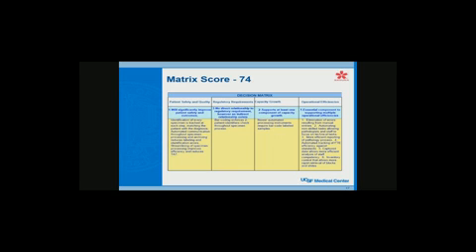Regulatory requirements: there's no regulation that says you have to use barcoding. Probably the closest is that you need to have 2 identifiers to have positive identification. But barcoding enforces a 2 identifier check because you're not doing human read, or making typos by handwriting things. So it gives you a stronger link between two identifiers.